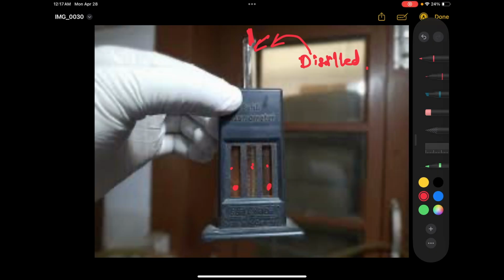One very important thing that I would like to add is how you are supposed to look while you are comparing. I don't have the equipment right now, but I can use this. For example, this is your hemoglobin tube, the hemoglobin comparator, and imagine that this tip is acting as a stirrer. Whenever you are doing the comparison, always keep the stirrer up, because if the stirrer is still in the tube, what will happen? It will look darker or lighter? Of course, lighter. So in order to avoid the effect of that glass rod in the comparison, you will always lift the stirrer above.